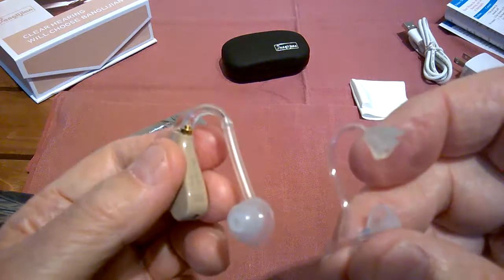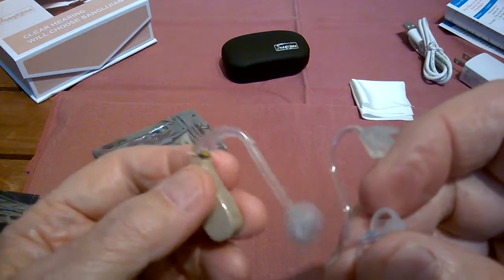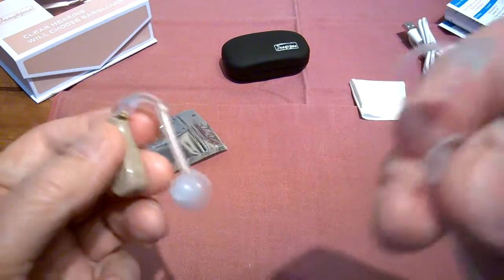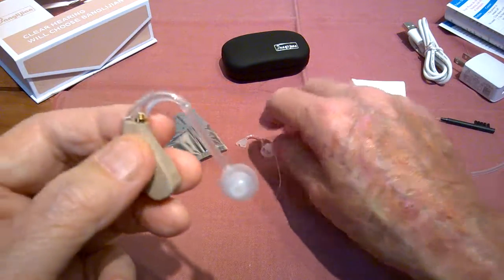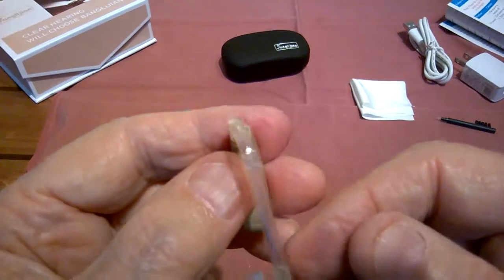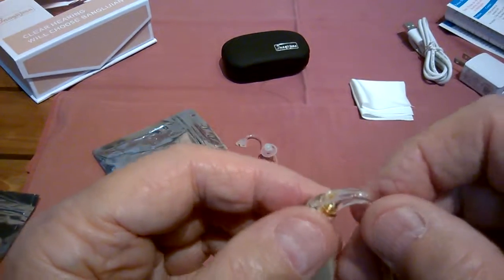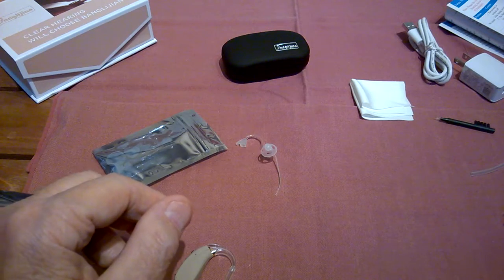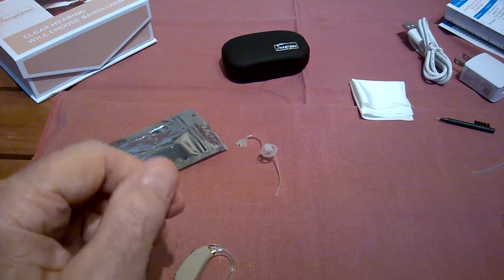So if being discreet is what you want to accomplish, use the small tube, left or right. They're both the same, different sides. And then this, if you want something just to use occasionally and be able to use it quickly. But that's basically the way you do it. Like I say, that's both types of tubes.